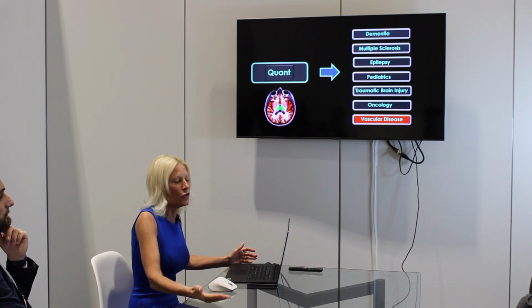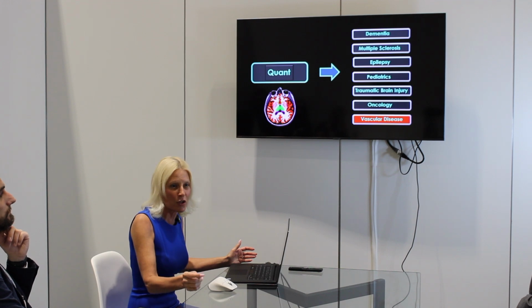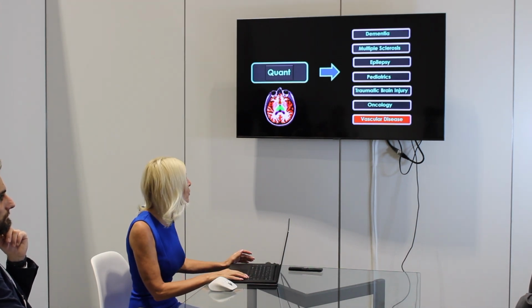I mean, we can't even go on the measurements of our previous colleague when they read the prior study. We have to remeasure the prior because that's how hard it is to get an accurate measurement. So again, volumes are the way to go.